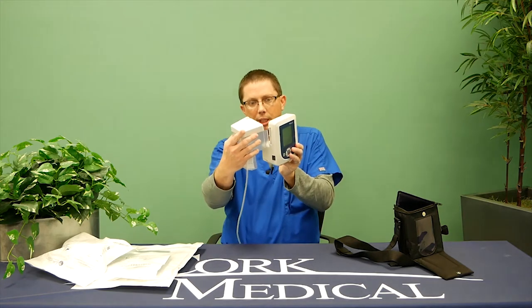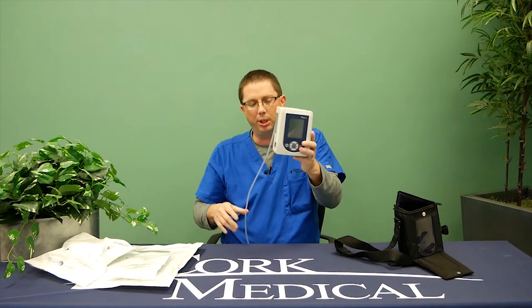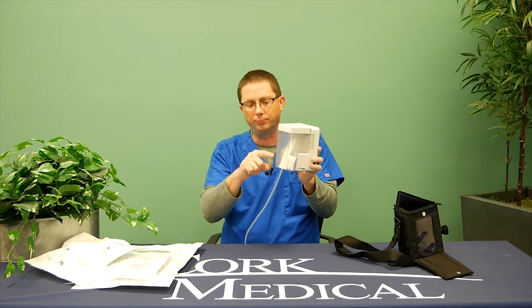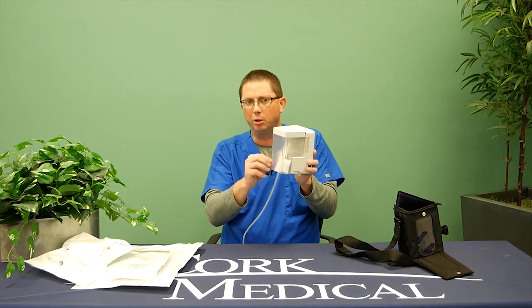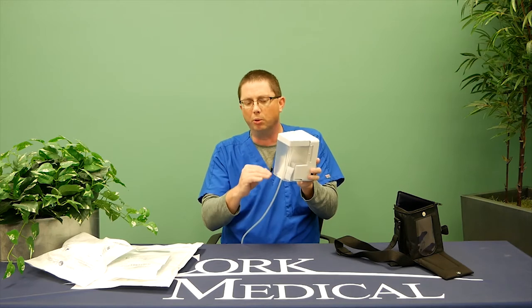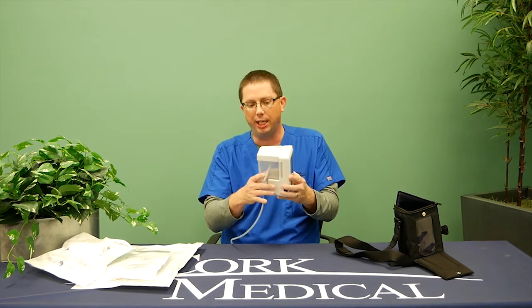Your home health nurse will initially attach the canister by hinging it in place, and you will see it fill up with drainage. The drainage can be a Kool-Aid color, a clearish color, or have a little tint to it — that's not abnormal. The longer you wear negative pressure, the less drainage you'll see inside the canister.